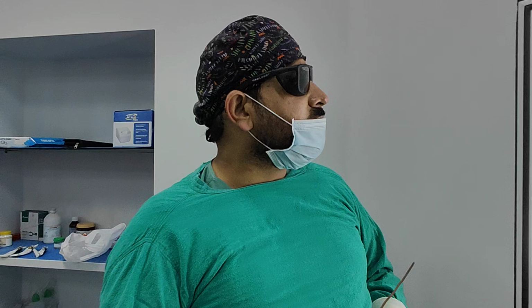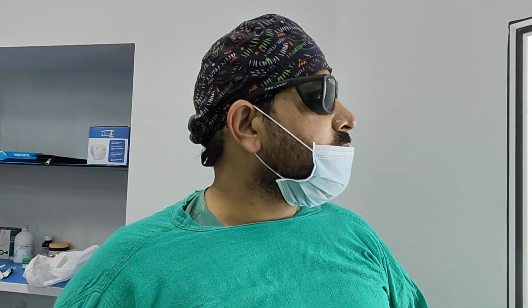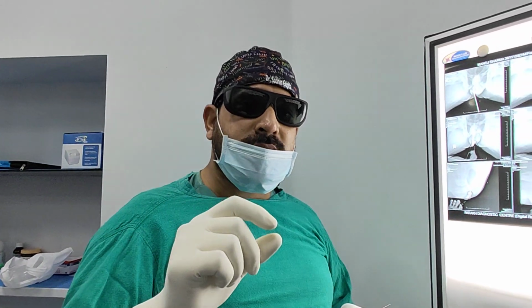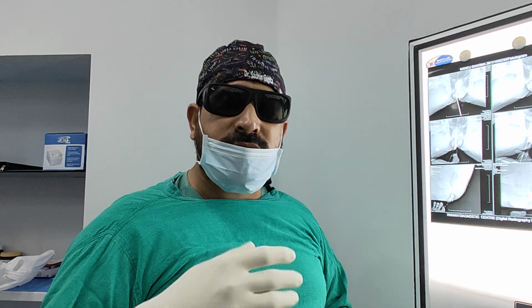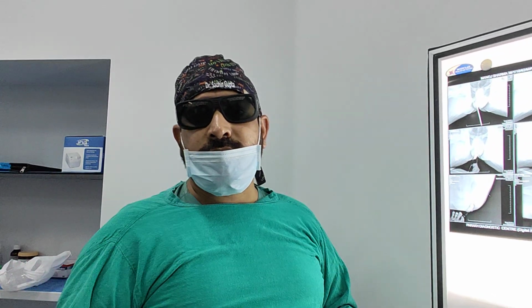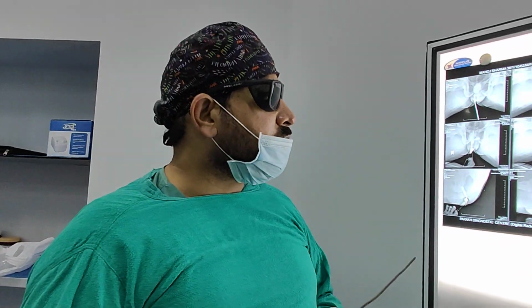Again with the case of complex high rectal fistula, I will explain this fistulogram. This is a patient from Ambedkar Nagar, Uttar Pradesh. This patient has pus and blood discharge from the perianal area, with a opening approximately 6 centimeters away from the anal verge. That is the presentation of the fistulous tract, and I will show you this tract in the fistulogram clearly.